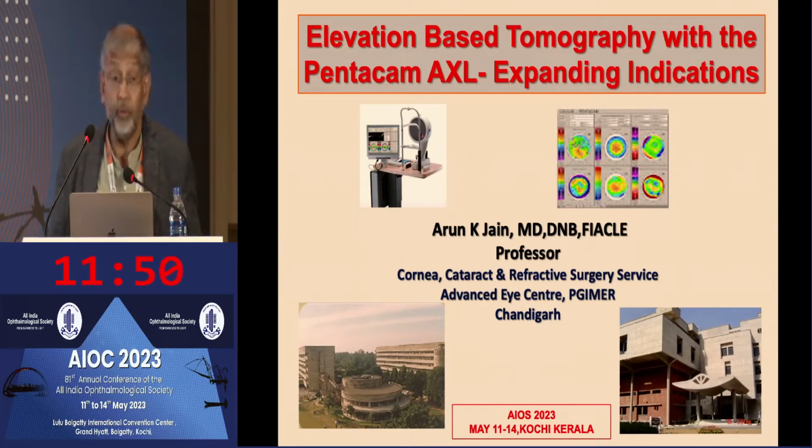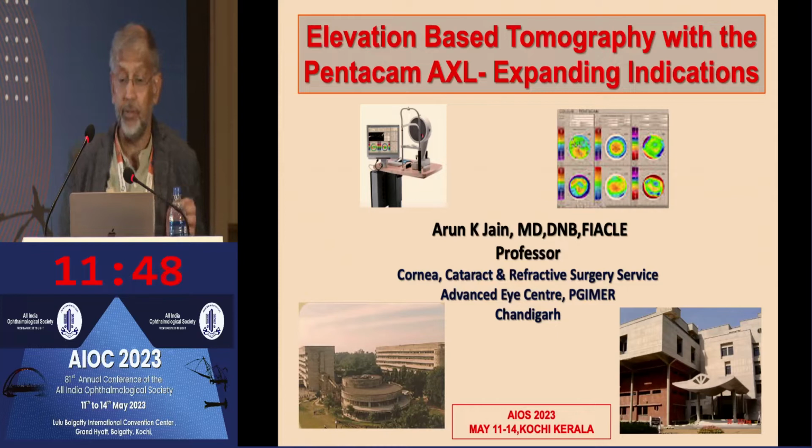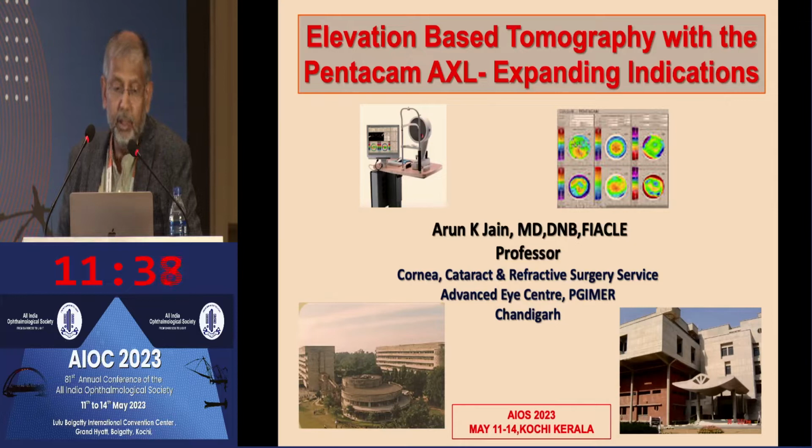And I'm going to talk about elevation-based tomography with Pentacam AXL, how to use this in various indications in ophthalmology. I'm not covering the AXL wave. It basically adds on a little bit more aberration, angle alpha, kappa, and centration of the lenses.